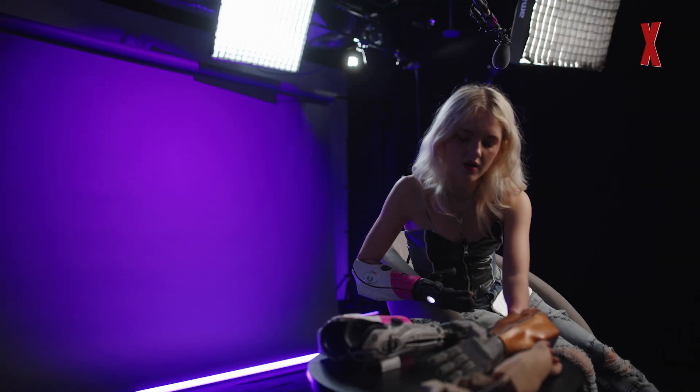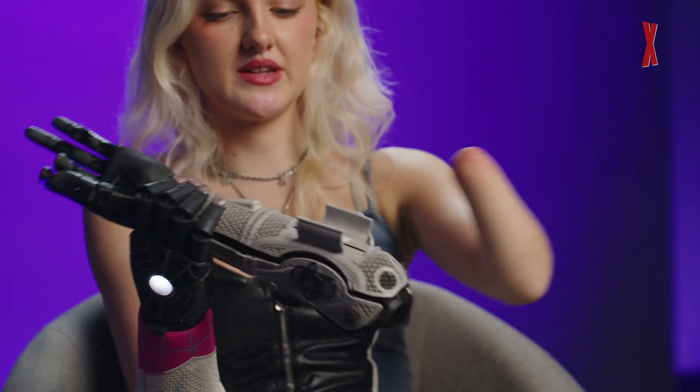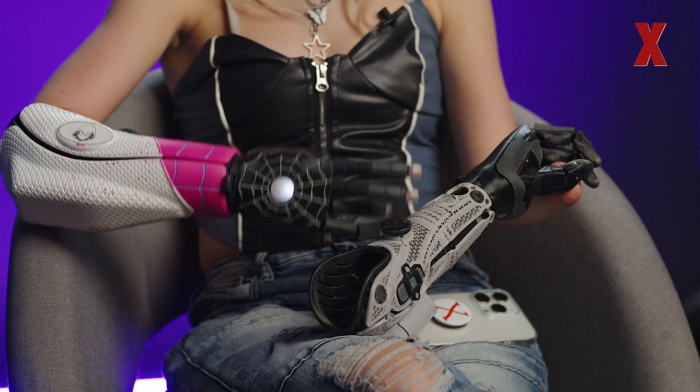The next one is kind of similar — just the next step in evolution. All these triangles? That's ventilation — proof that the ventilation issue was fixed. This is also where the battery now goes. The wrist is now where it is on my current arm, and the sensors are now in the center. It's 3D printed ventilation.